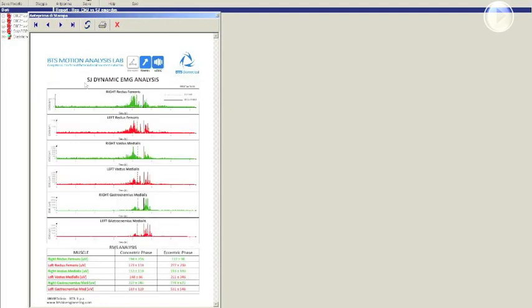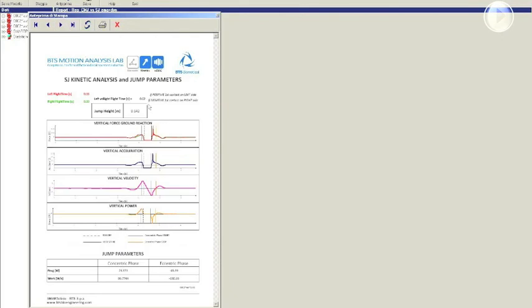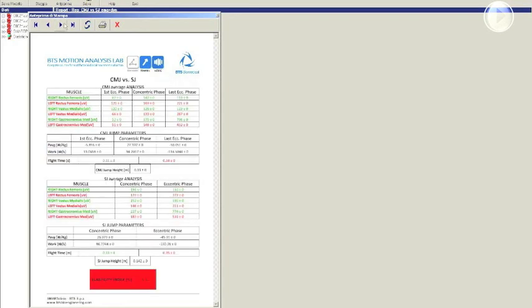Same thing for the squat jump dynamic EMG analysis, in which we can see the rectified signal with the events of toe-off and heel strike for both sides, the RMS average over the different phases. You can see that in this case the squat jump is related to just 2 phases, the concentric one and the eccentric one. Then still the kinetic analysis, so also in this case we will see the same application, and in the last page we will have the comparison, the direct comparison, counter movement jump versus squat jump.